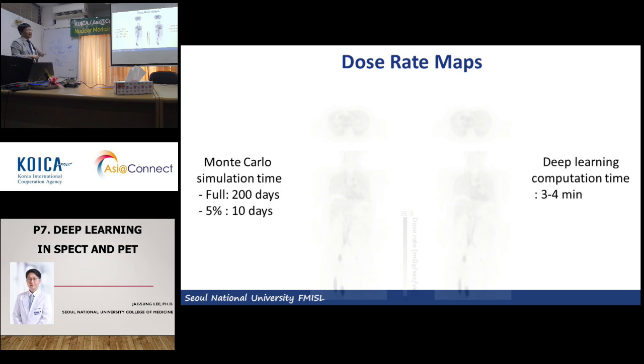Yeah, so skipping everything. Actually, in the old days, people just used the same S value for all of the voxels. In the textbook. Yeah, but we have devised a new method, in which we use multiple, about 20, S values that depend on the tissue property, based on each attenuation coefficient or something.